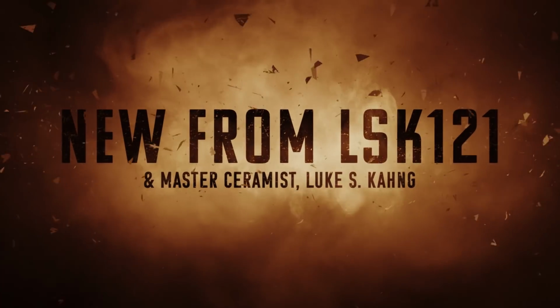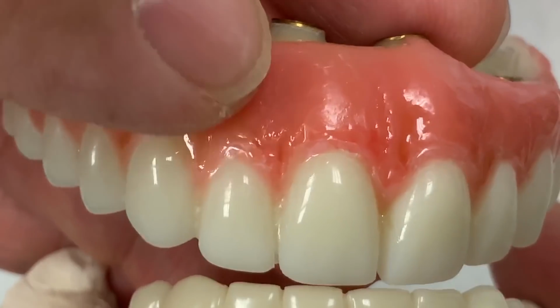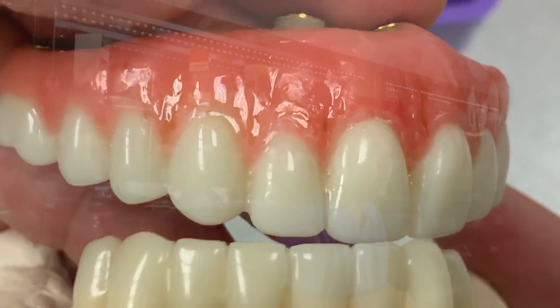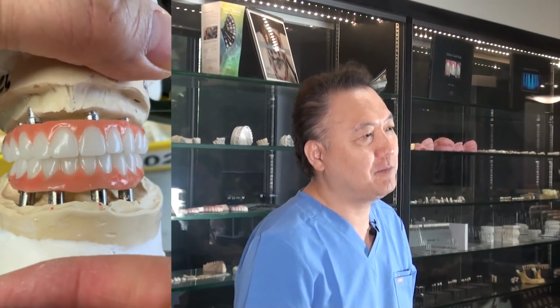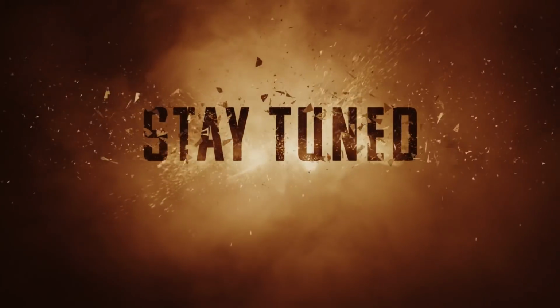Today's topic is temporary, long-term provisional cases. A lot of people have questions about how we can build them, either on the dentist side or laboratory fabricated. But today is the day. I want to show you how we can make these long-term temporizations in a unique way. You really want to watch it? Stay tuned.